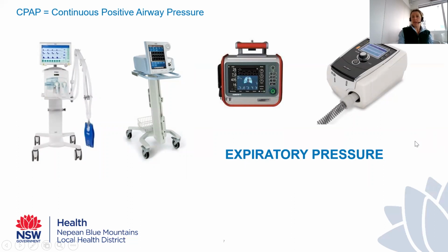CPAP is a mode of non-invasive ventilation where we are applying a continuous positive airway pressure. So it's a positive pressure that's applied throughout the entire respiratory cycle. So that's both when we inhale and exhale, but where we actually feel it, or where the patient feels it, is when they're breathing out. So they're breathing out against a positive pressure.